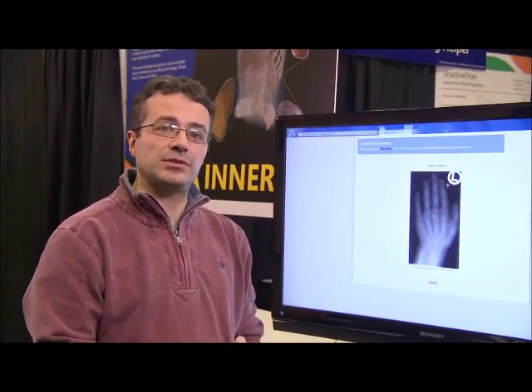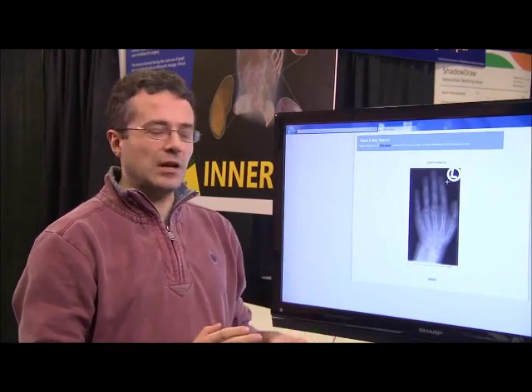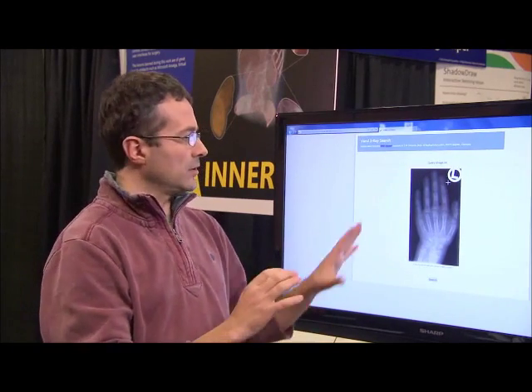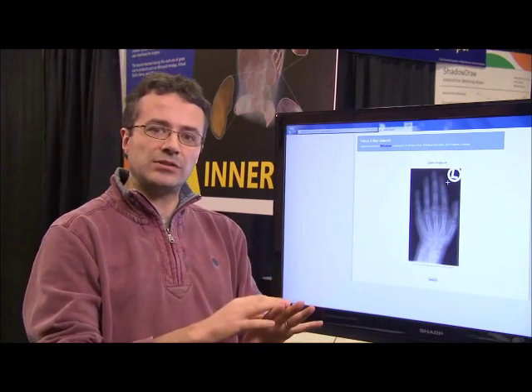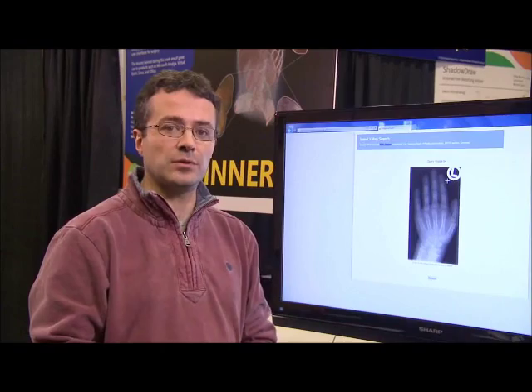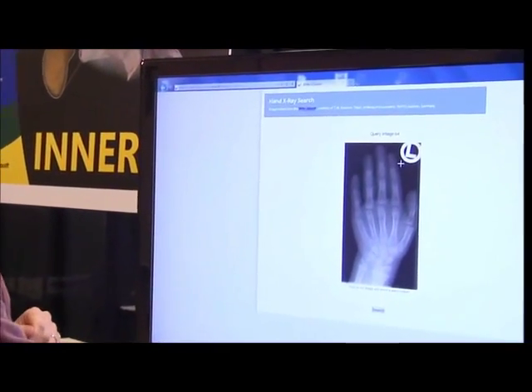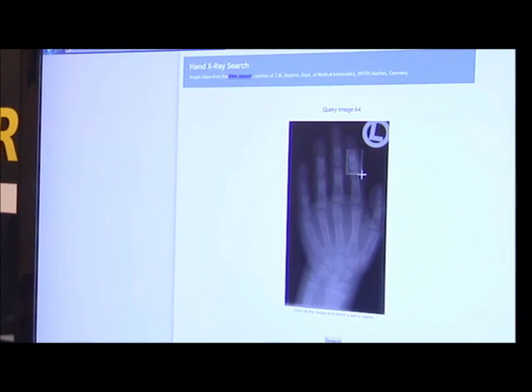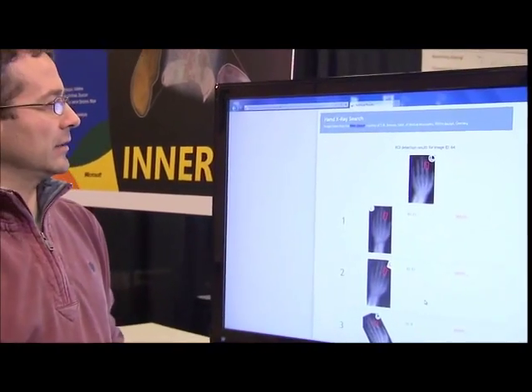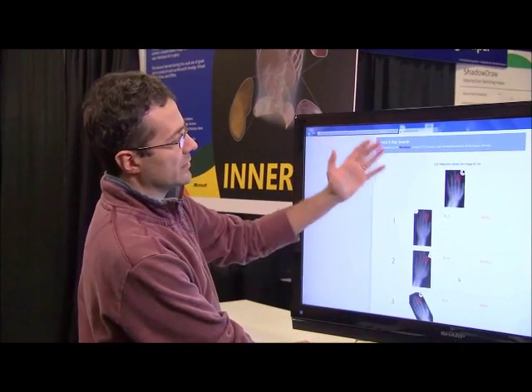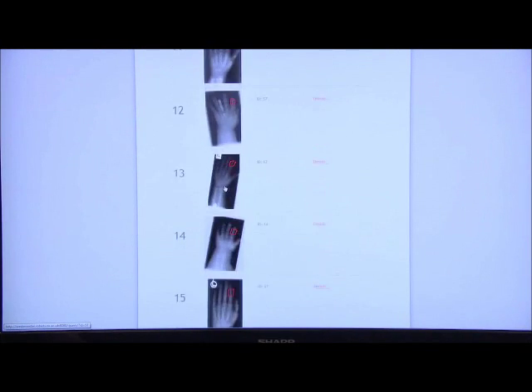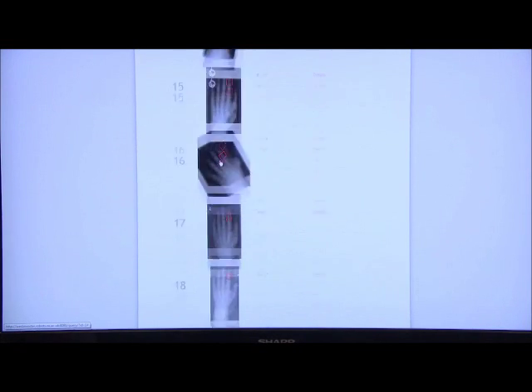In this other demo we are going to be talking about content-based retrieval of medical images. Imagine that you have a patient and you have x-rayed his hand and you want to isolate a particular feature of that hand and also match it against a very large database of patients which have come through your hospital. We are going to just click on the image and select a region and then click on the search button. The system goes off, the computation happens on a server, and you get returned a very large set of images of other patients with exactly the same anatomical part highlighted in all of them.